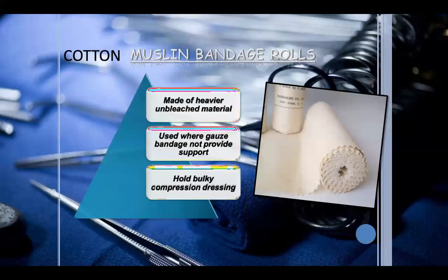Then there are the cotton bandage rolls, different from gauze rolls. They are made of heavier, unbleached material. The natural cotton cloth is used where gauze bandage does not provide enough support. So when there is a heavier, more supportive need, these are applied to hold a bulky compression dressing. Sometimes there is a heavy dressing, and then you apply these muslin bandage rolls.